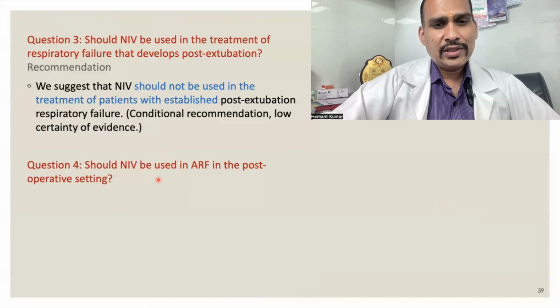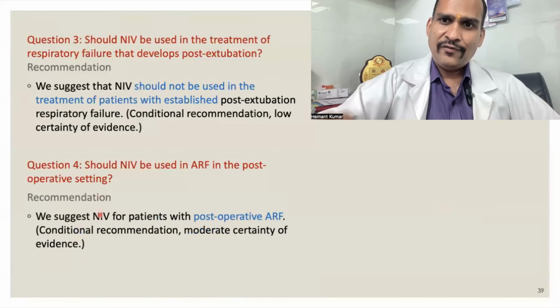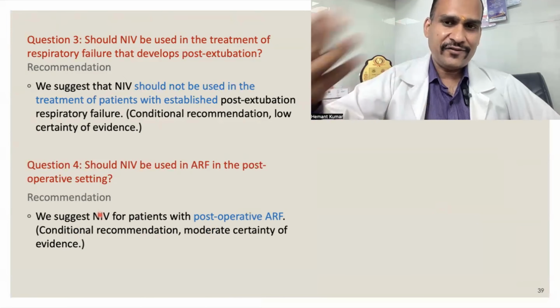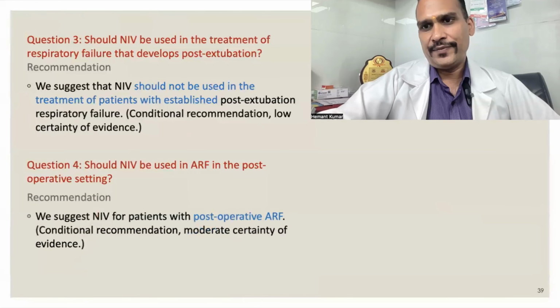Should NIV be used in acute respiratory failure in the post-operative setting? Yes, for prevention and for treatment also. For prevention of respiratory failure, and if the patient develops respiratory failure, we can use NIV.